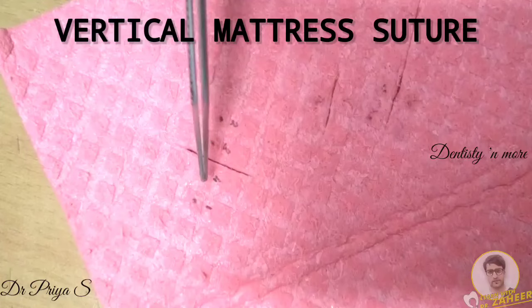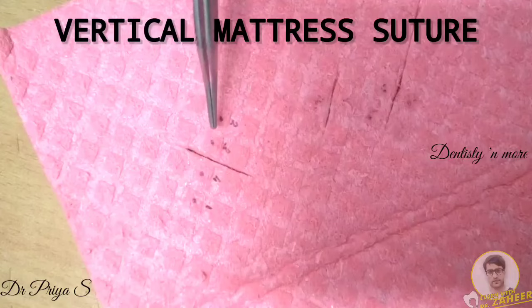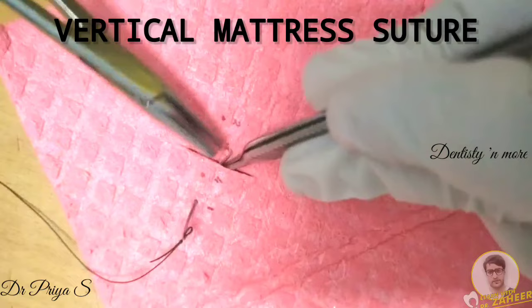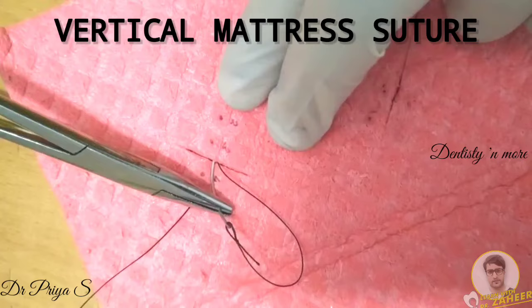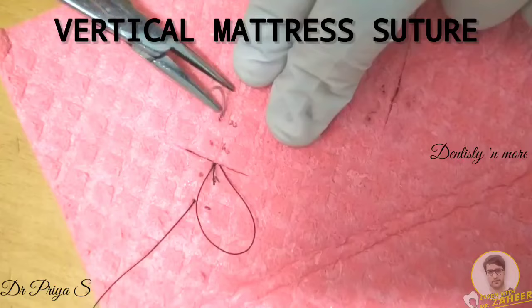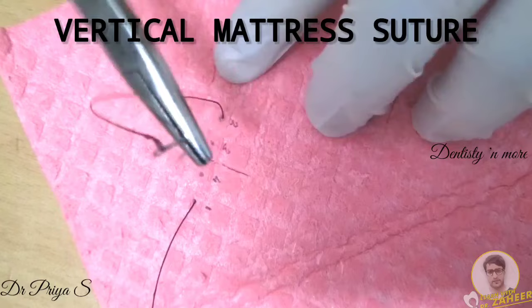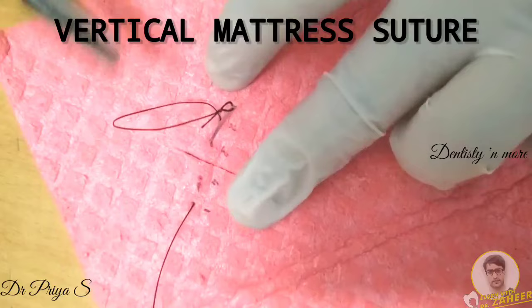Here I have marked the points where the needle enters and exits the tissue. Points 1 and 3 are entry points; points 2 and 4 are exit points. The suture first enters the tissue through point 1 and emerges out on the opposite side through point 2 — both bites are of the same depth and equidistant from the wound margin. The needle is then reversed and returned with a very small bite through point 3, which emerges out on the other side through point 4.